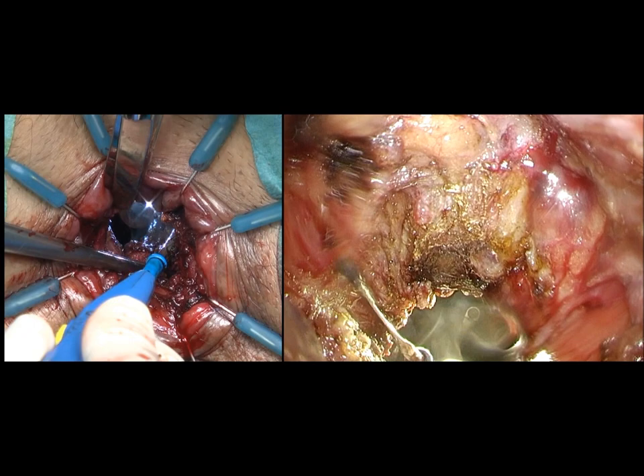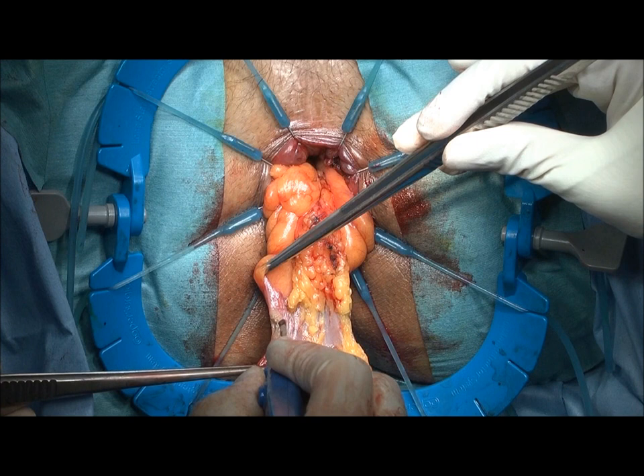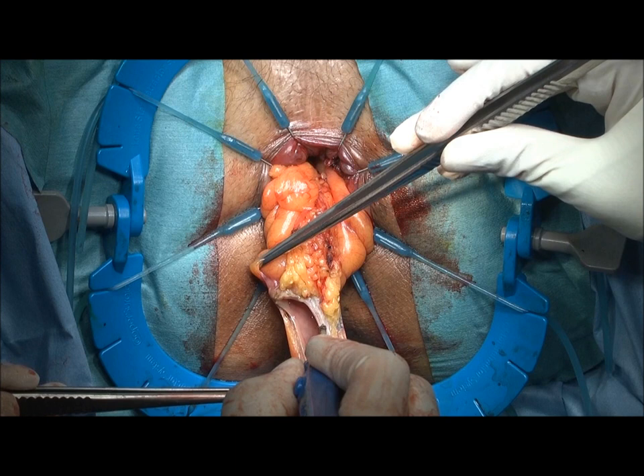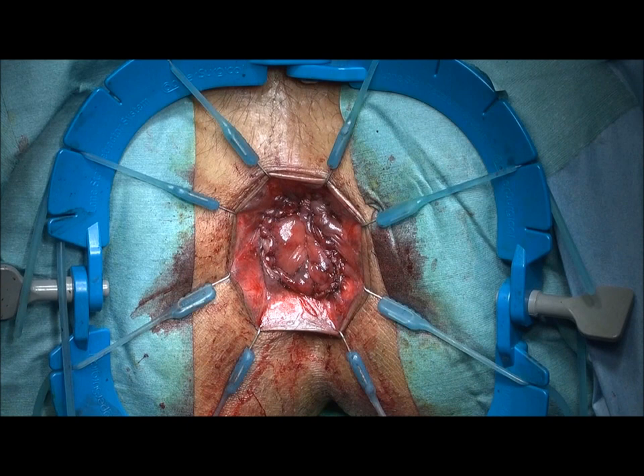After completion of the dissection, the specimen is retrieved from the anus. The anastomosis is completed with 16 vertical mattress sutures.